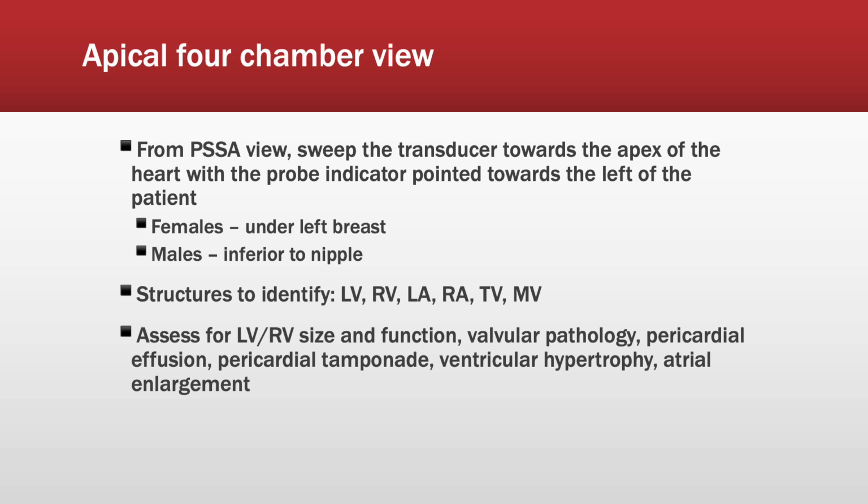Lastly, in this view, you can assess for left ventricular and right ventricular size and function, valvular pathology, pericardial effusion, pericardial tamponade, ventricular hypertrophy, as well as atrial enlargements.